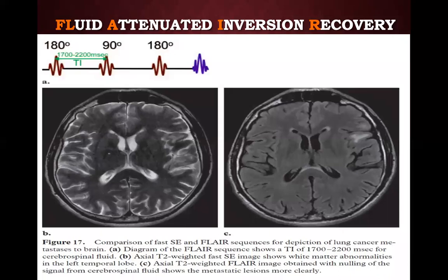This is important. Why? FLAIR sequences are important not just to detect the increased signal, but to see lesions near the surface of the cortex, which is very close to water. That is when this is important. You are inverting the signal coming from water, from CSF.